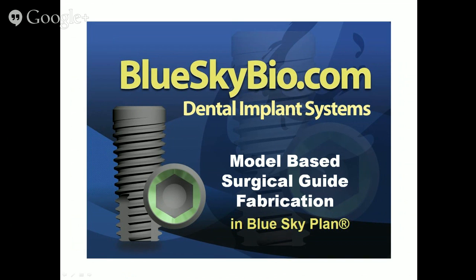The focus of the presentation today is model-based surgical guide fabrication in Blue Sky Plan. We're focusing specifically on model-based surgical guide fabrication. We're not going to be discussing the second option of digital design, but we will be discussing what the difference is and the advantages of the model-based surgical guide fabrication.